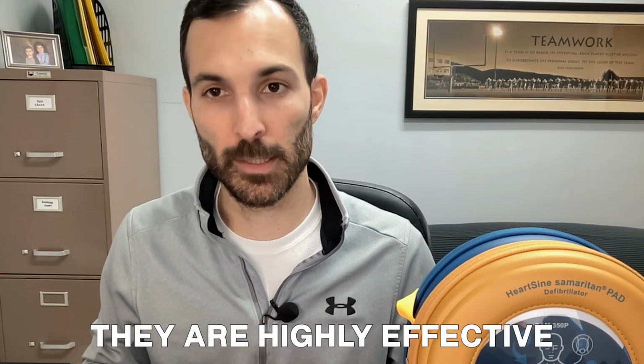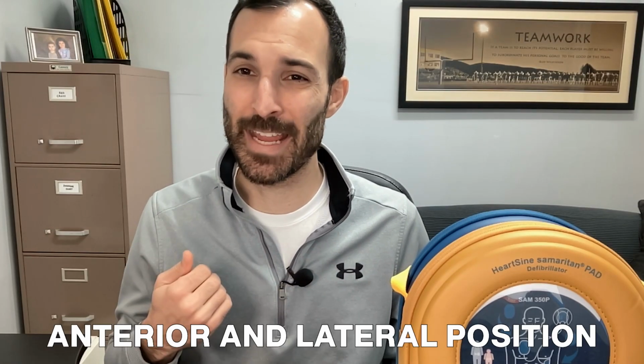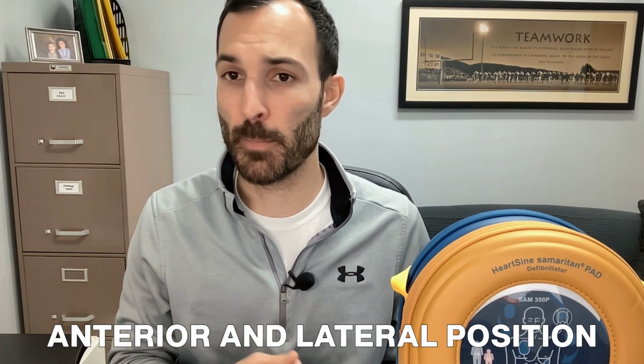Okay, so the important thing to take note of with AED machines, big picture, is they are highly effective in restoring the normal cardiac rhythm of somebody's heart. So in other words, your heart is like a battery. It has electrical impulses in it. It's about the size of your fist in the middle of your chest. We place the AED pads on the upper right and the lower left. We call that the anterior and lateral position in pad placement. So that way those pads, those electrodes, can analyze the heart's electrical activity.